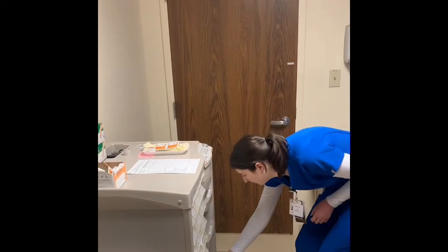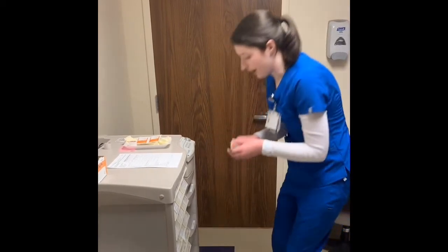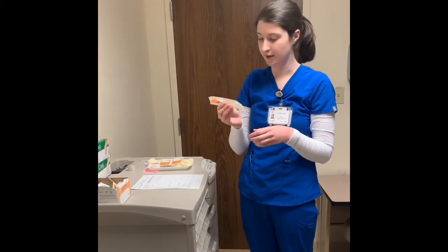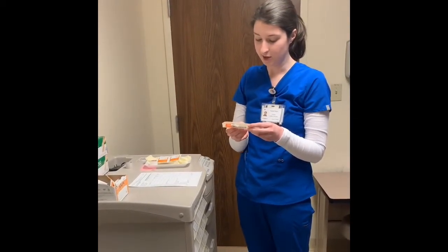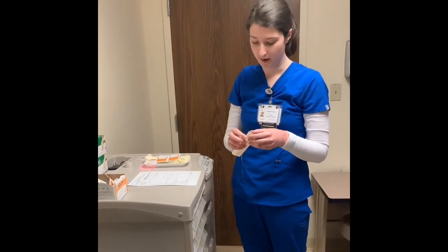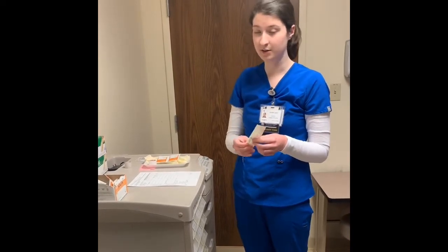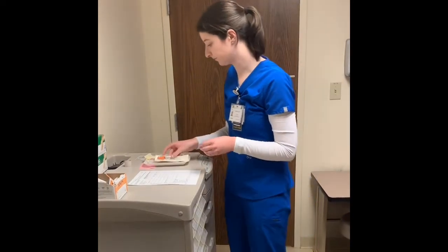Now I'm going to grab my syringe. So here I have a 29 gauge half-inch insulin needle and syringe that comes pre-prepared. Its expiration date is 6/30/2023, so this is not expired. The packaging is intact, not damaged in any way, and it's unopened, so its sterility is maintained, so this should be safe for me to use.